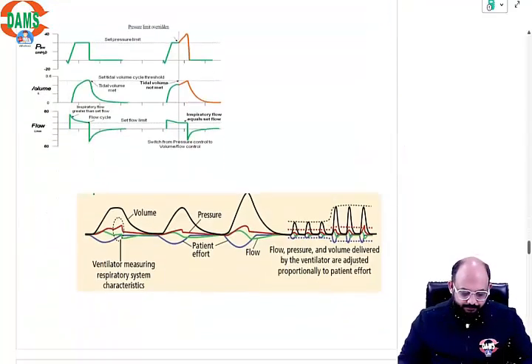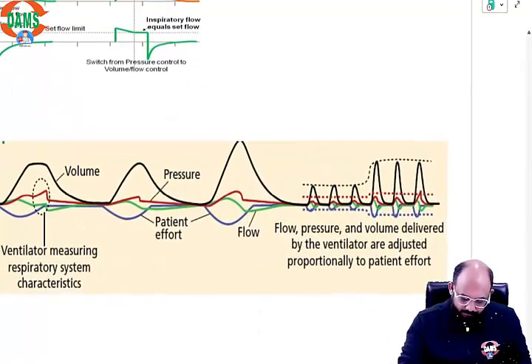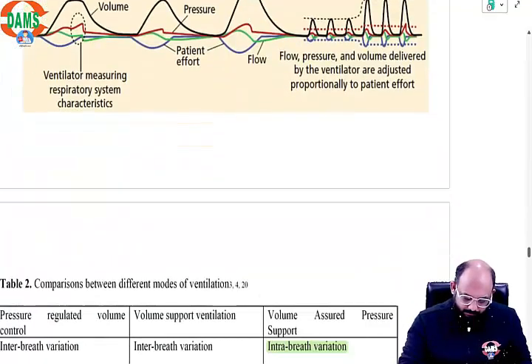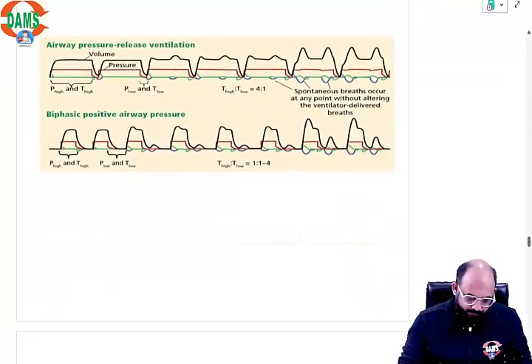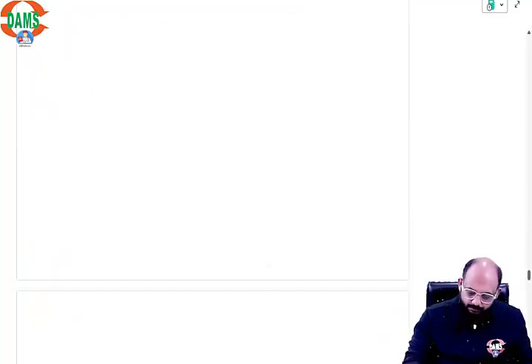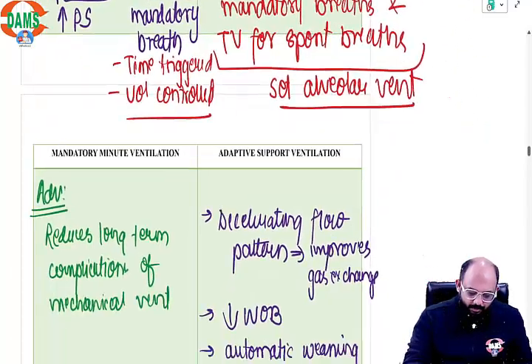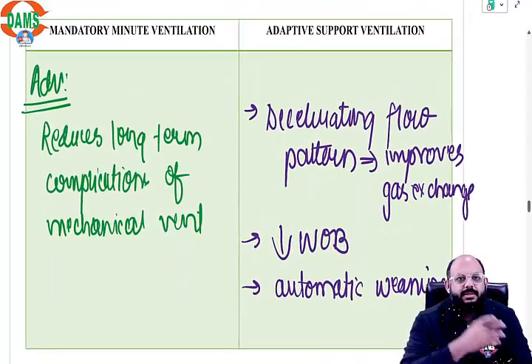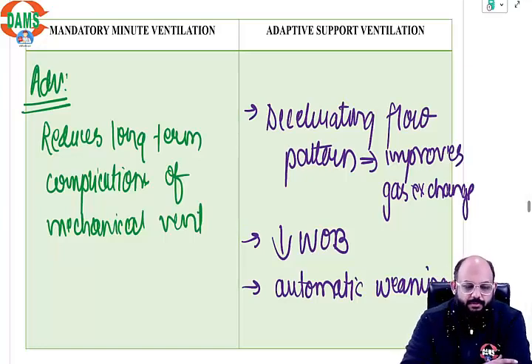See, this is the difference between, I'll tell you how adaptive support ventilation is different from mandatory minute ventilation. I'll show you the graph later.